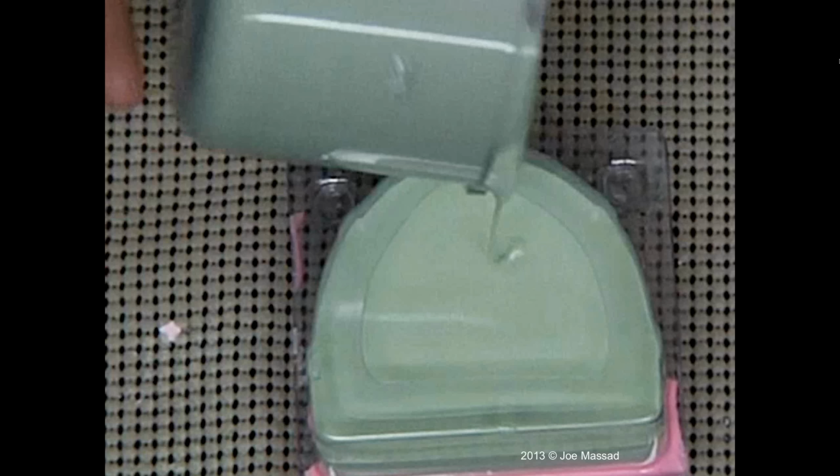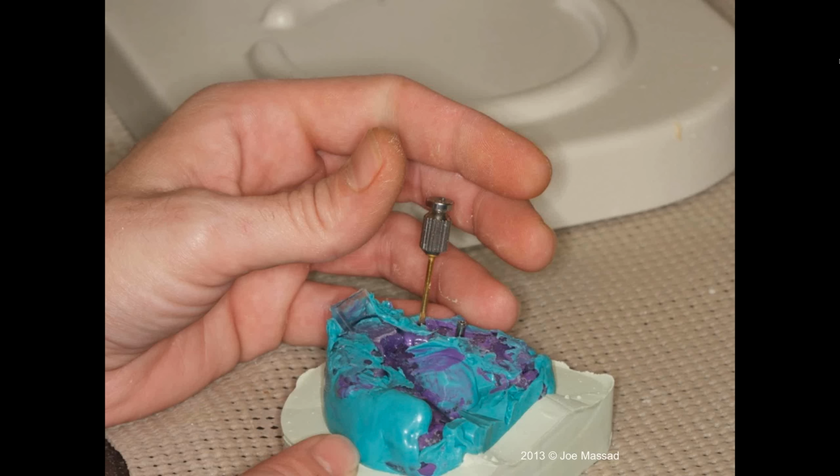So let's go ahead now that we have it, and we'll unscrew the open tray and then extract it. You can see the integrity of the impression. And why are we taking this out? Because I'm going to go ahead now and do a verification, which is, if we're going to do a bar, I think that's important to do that.